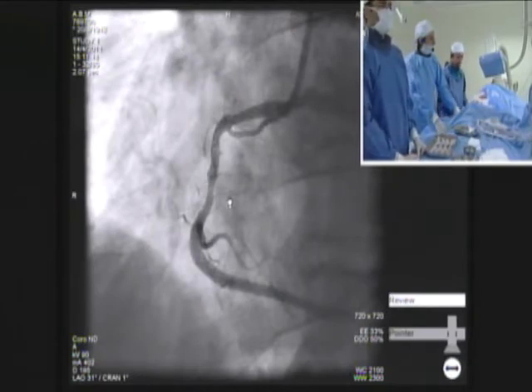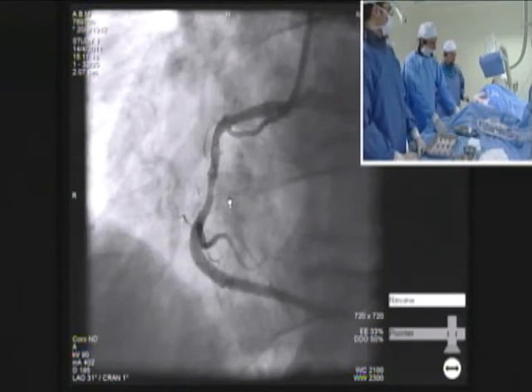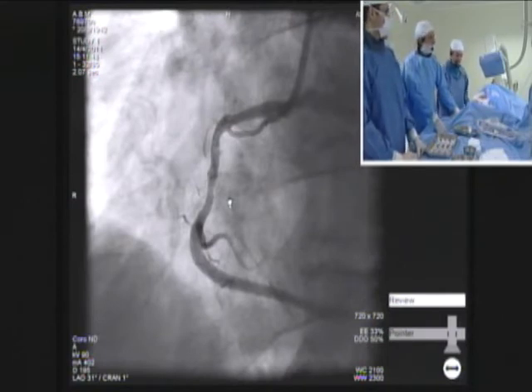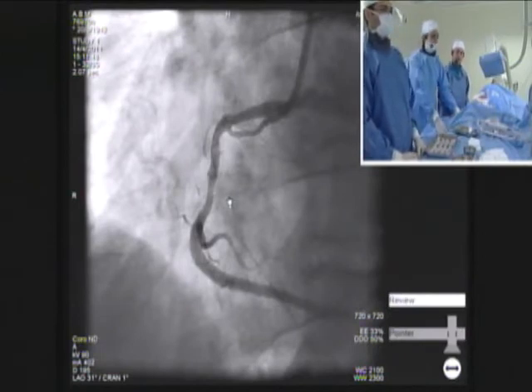Yeah. In the right. So, okay, so let's go step by step. I thought that you guys would help me a little bit more. Yeah, I thought that you would be helping more, but I thought that there is no real consensus there. But let me share with you what we did. First, we decided to investigate the right. And what we did, we put an IVUS catheter, so we collect some images that Ricardo is going to show you. And then we also did FFR, just to really illustrate and to see if there is an agreement between the two methods.